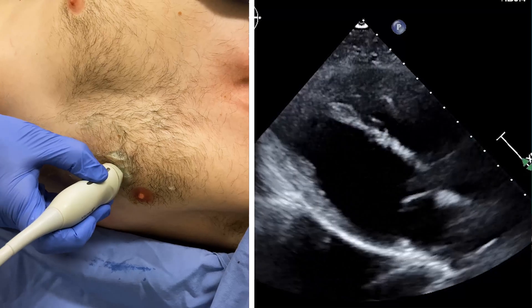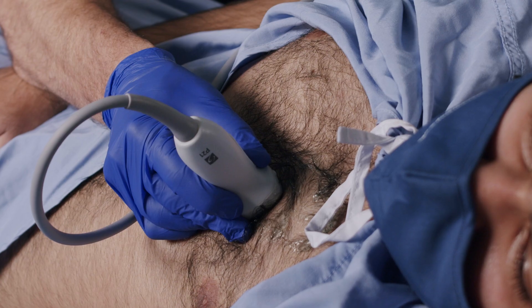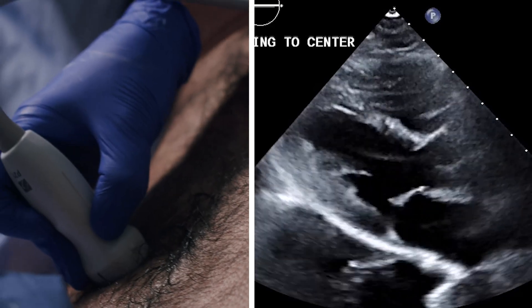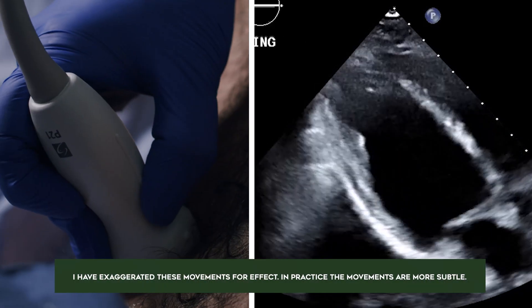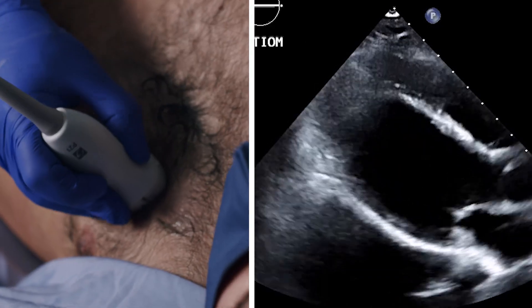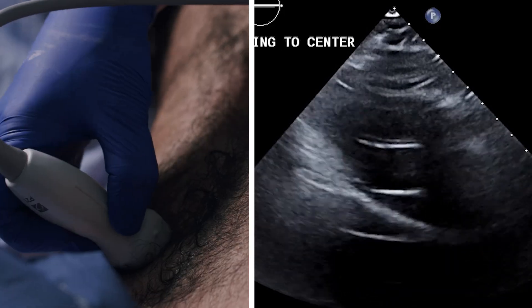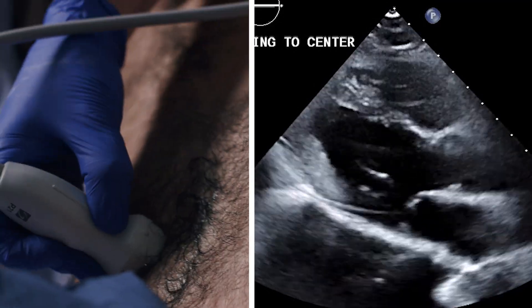Every patient is different. We may have to slide up or down into a space to see all the heart. Once we find the heart, we use small movements to optimize and center the image. We slide medially or laterally to center the image, and we can also use rocking to better center it on the screen. We use small rotational movements to make the heart as long as possible. Finally, we may tilt the probe to make sure that we are in the center of the heart. These movements are small and relatively subtle.